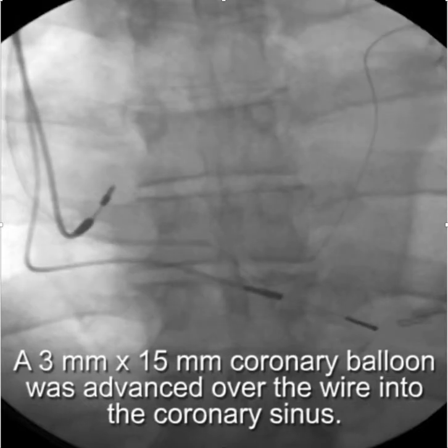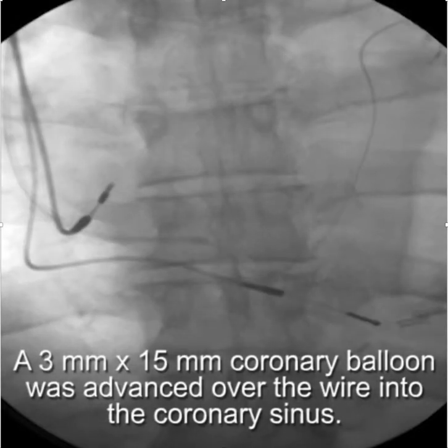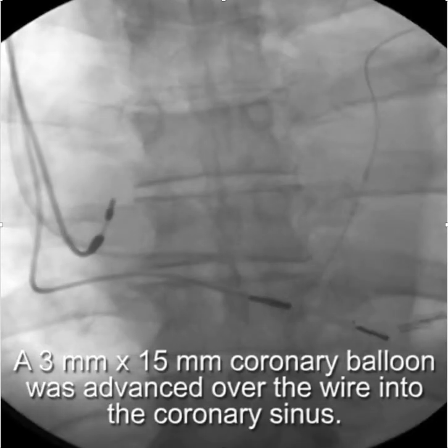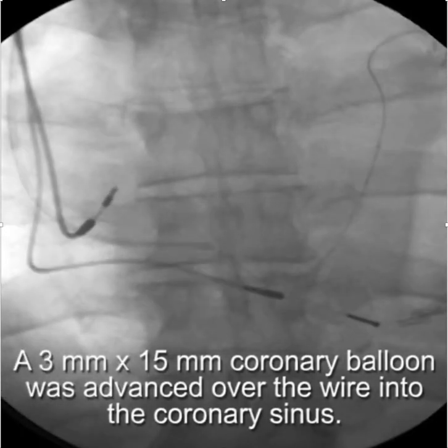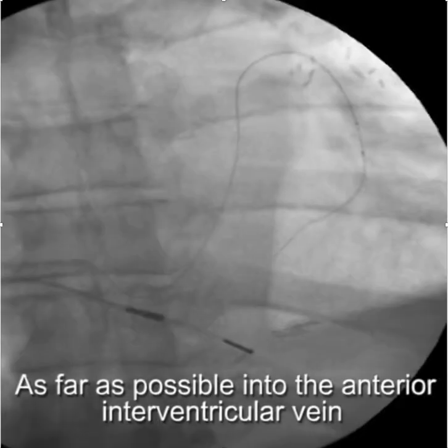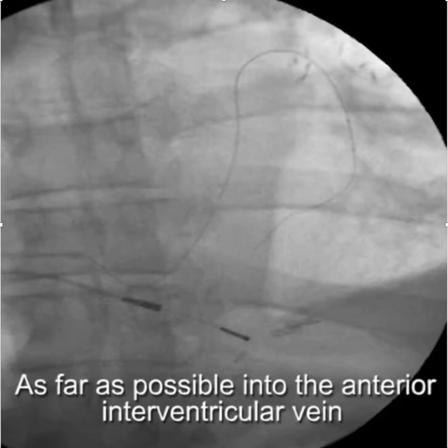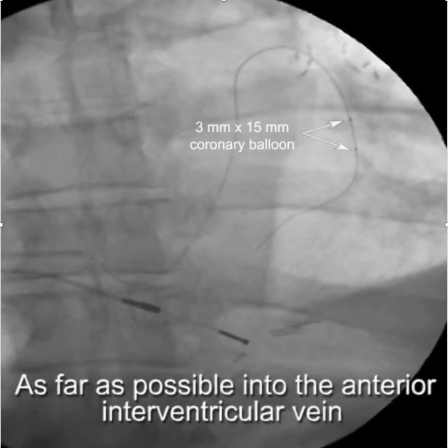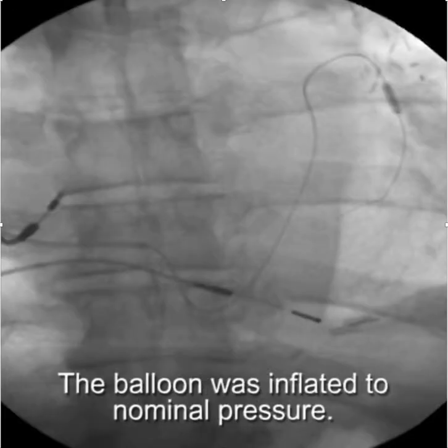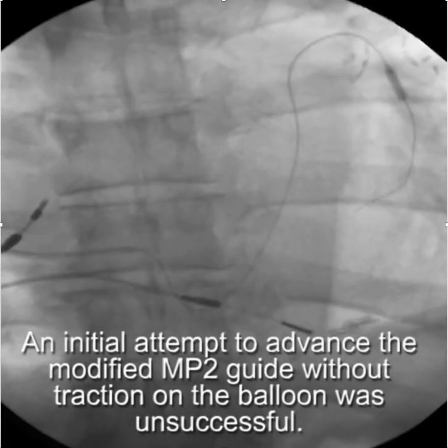At this point we advance a three-millimeter by fifteen-millimeter coronary balloon over the wire into the coronary sinus, and as far as possible into the anterior interventricular vein or any small vein, and then inflate the balloon to create an anchor.